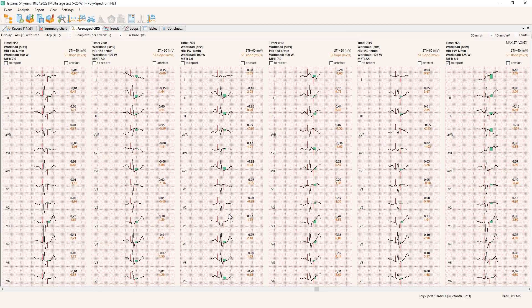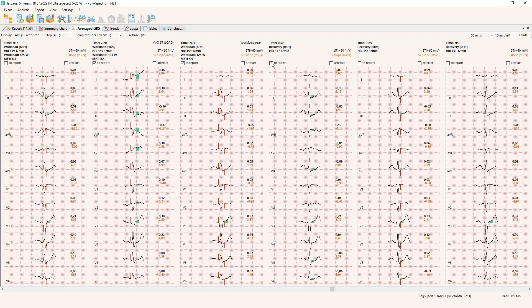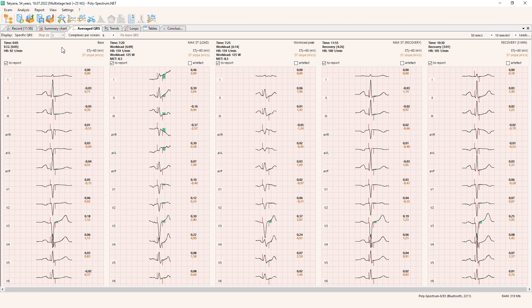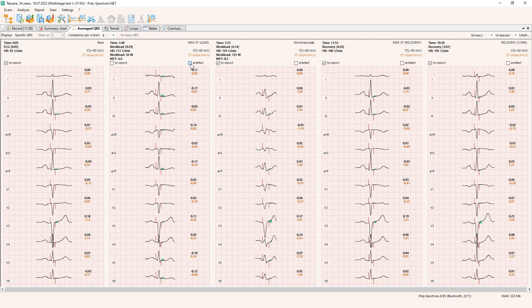If something is suspicious for real ST depression, I can double click the QRS complex and check what's happening on the real ECG. If there is actual ST depression I can print it out or mark it as ST depression. No ST depression here really. The software provides a selection of four or five standard QRS complexes: the beginning of the test, maximum ST deviation during the test, ST during maximum workload, and some recovery data.